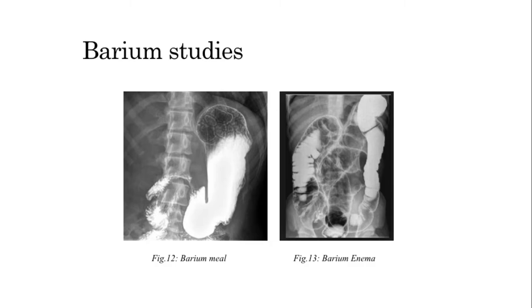Whether it was induced through external means, sometimes we induce a negative contrast or radiolucent contrast to actually highlight the bowel even more. You can induce it via a mechanical method. There is a device for that. Or you can induce it by giving the patient soda, and that will induce bowel gas. We do that in the radiology department. It's a very special procedure. So this is positive and negative contrast.